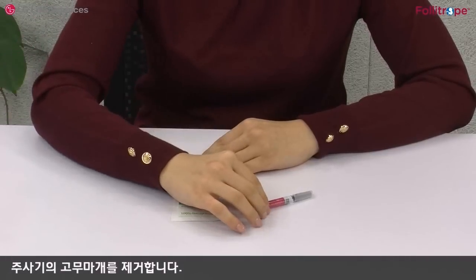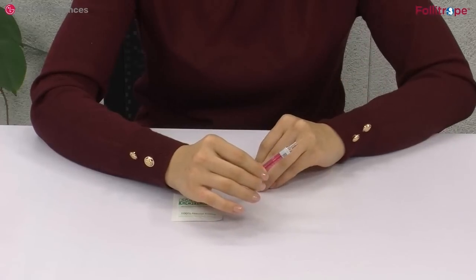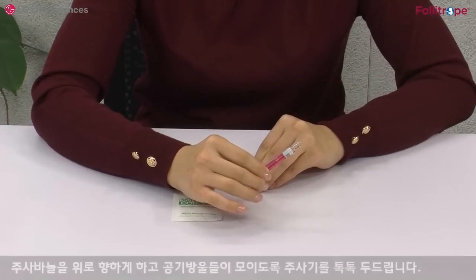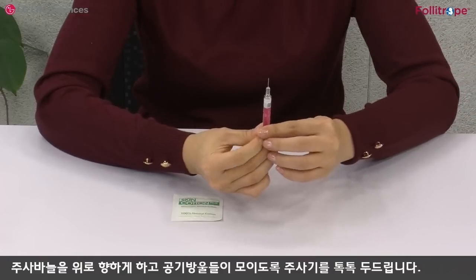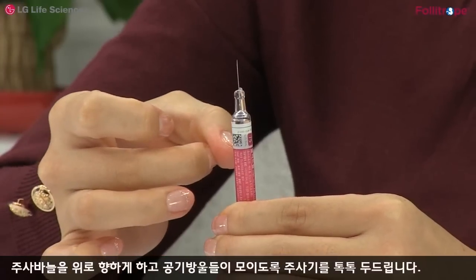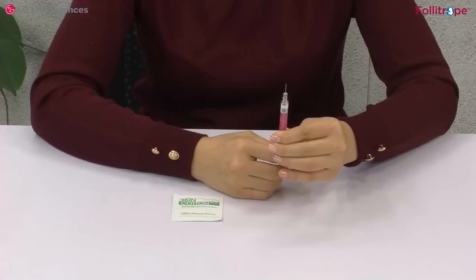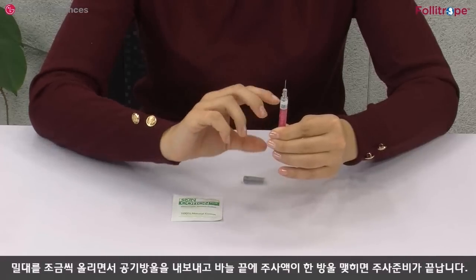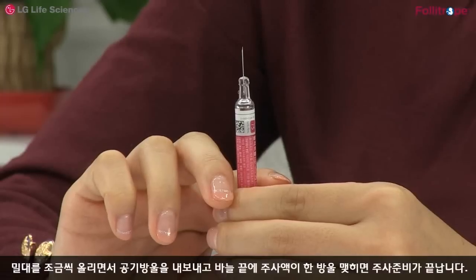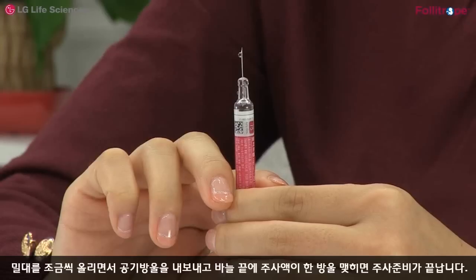주사기의 고무마개를 제거합니다. 주사 바늘을 위로 향하게 하고 공기방울들이 모이도록 주사기를 톡톡 두드립니다. 밀대를 조금씩 올리면서 공기방울을 내보내고 바늘 끝에 주사액 한 방울이 맺히면 주사 준비가 끝납니다.